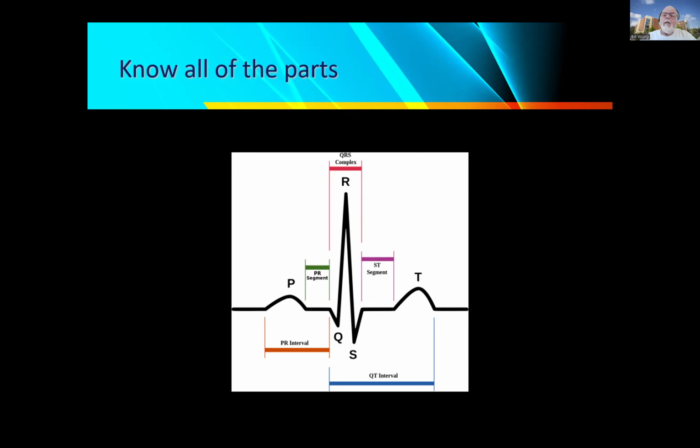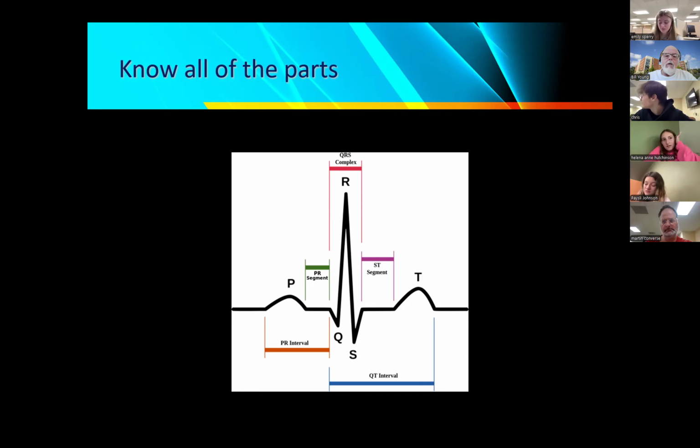Okay, Marty, you're up on my screen. Tell me what the P wave represents on the EKG. Atrial depolarization. And ladies and gentlemen, that is said perfectly.